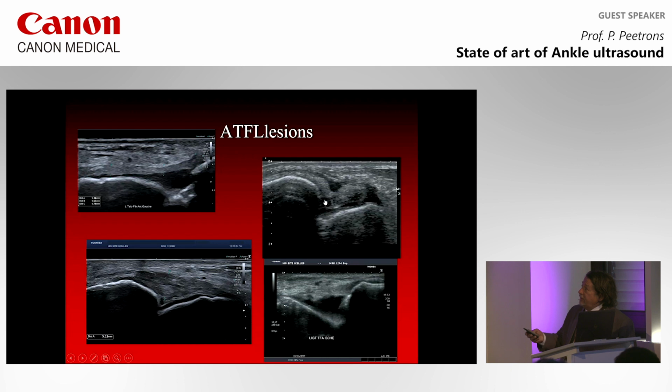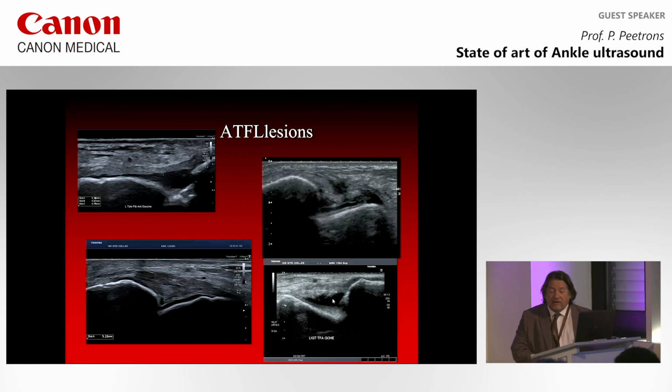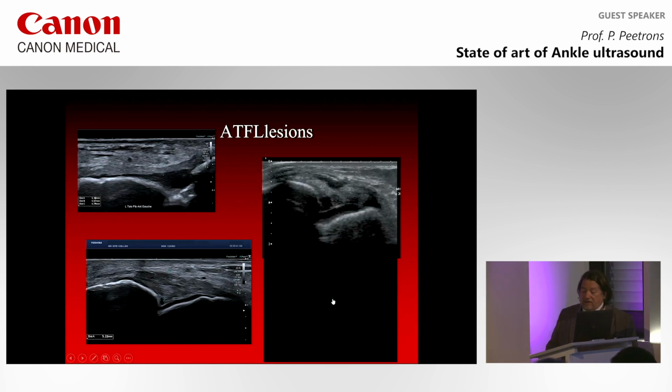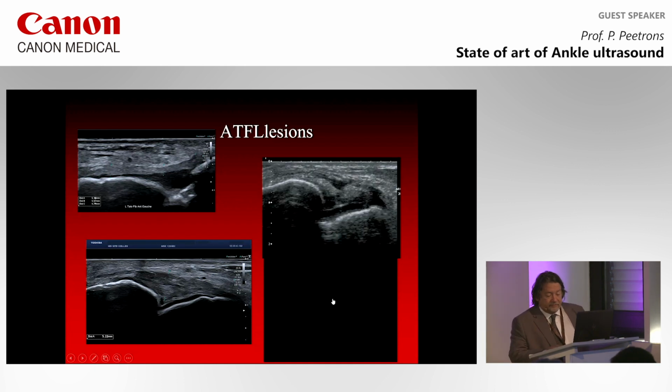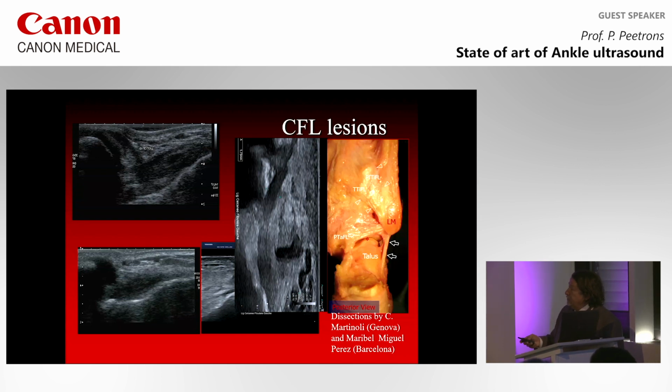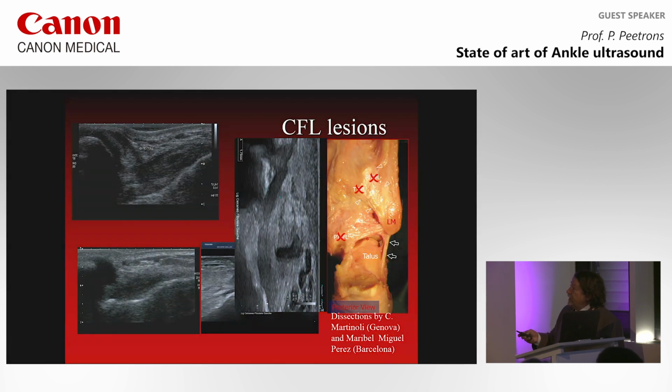So you can see here the acute lesion of an ATFL, where you see that the ligament is torn from the talus part and just floating in fluid. And here you can see also that the ATFL is disrupted, and there is a part of fatty tissue which is inside the ATFL. So the CFL lesions, calcaneofibular lesions, you can see here that the calcaneofibular ligament is coming from the calcaneus, going over the talus and reaching the lateral malleolus. And this is now, with the new equipment, very well seen.